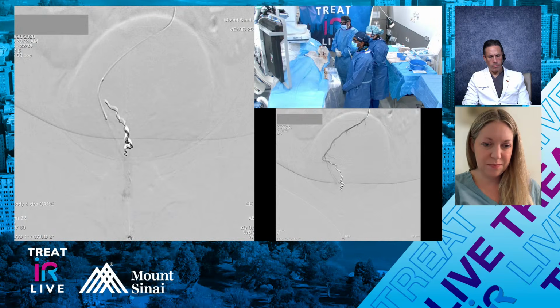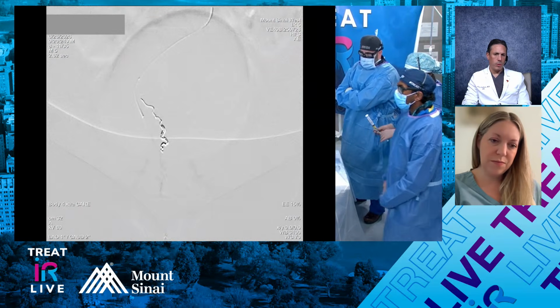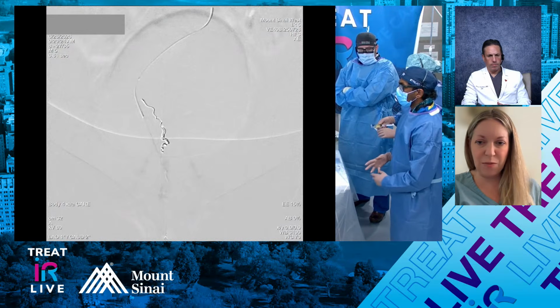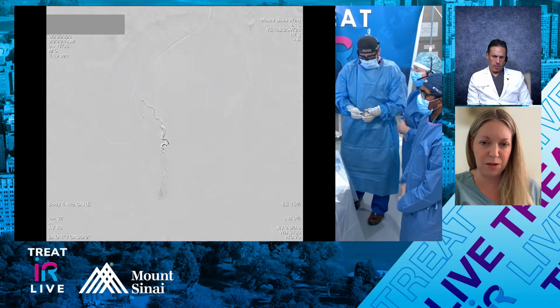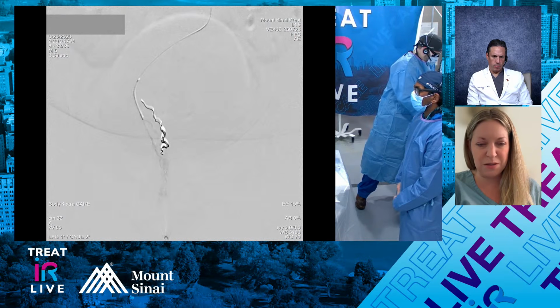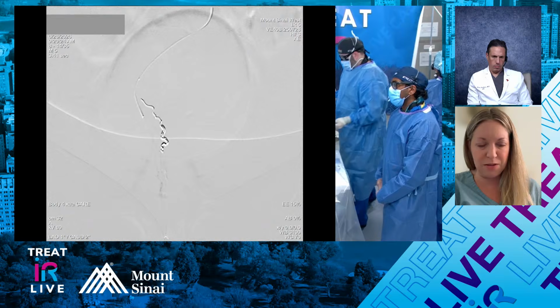Jesse, are you doing general angios like aortograms at all to look at middle rectals when you start, or do you just go straight for the superior rectal off the IMA? I go straight to the IMA, and then I'm looking for big anastomotic connections, CCR, from the middle, and they'll almost always show themselves from that IMA run. And sometimes if you get more selective, you'll see it better. But pretty much just focusing on the IMA and the superior rectals.